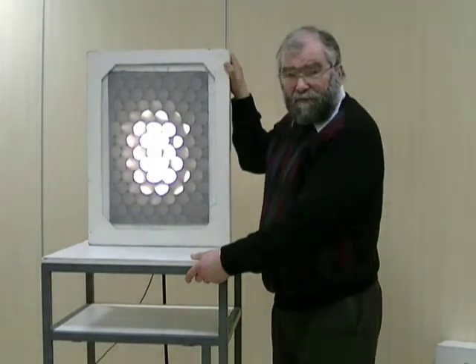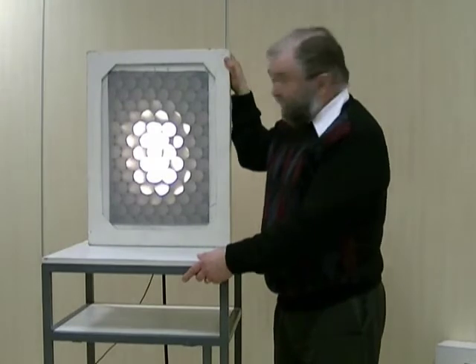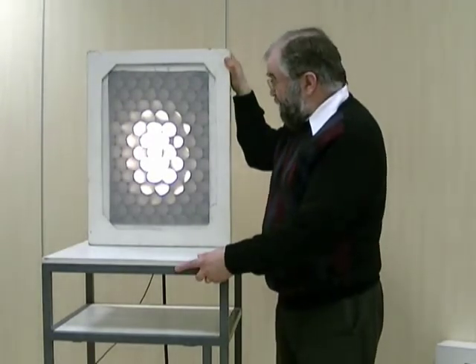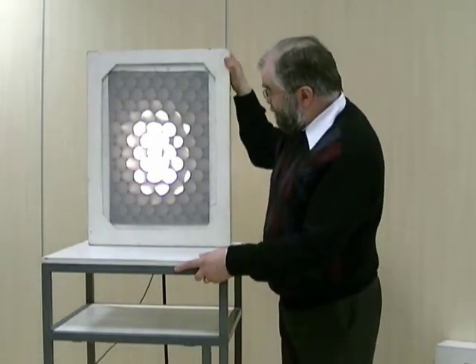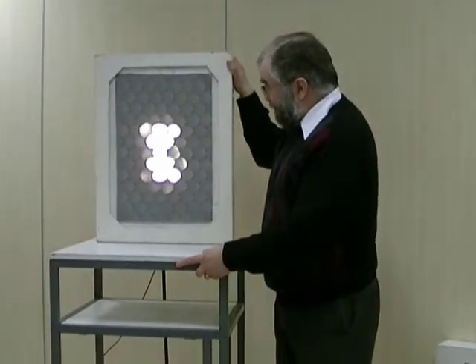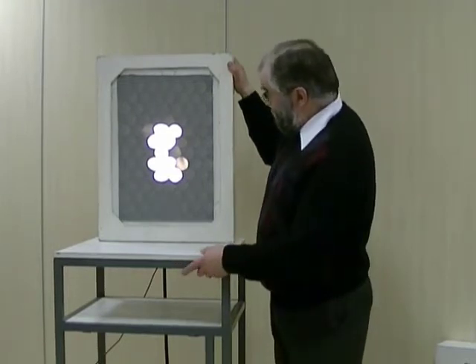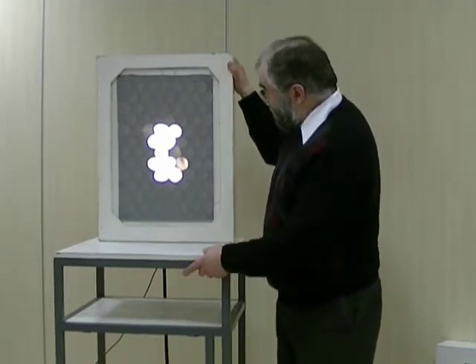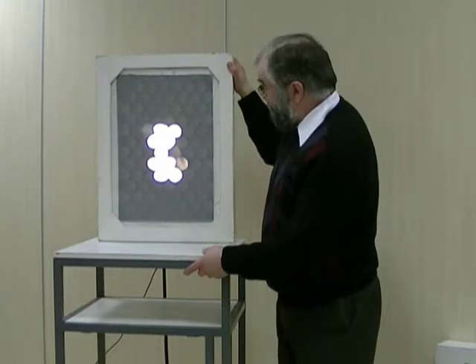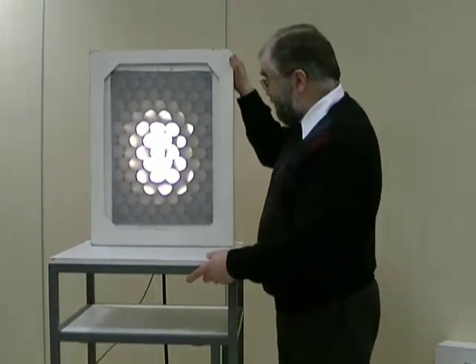It looks like one large source rather than two separate ones. So the resolution has got worse as we get further away, but the magnification hasn't changed. The parallel hole collimator gives us a magnification that doesn't change with distance. Here the two sources are the same distance apart, and the two images are the same distance apart, but when close they're resolved; when further away they're blurred into each other and no longer resolved.